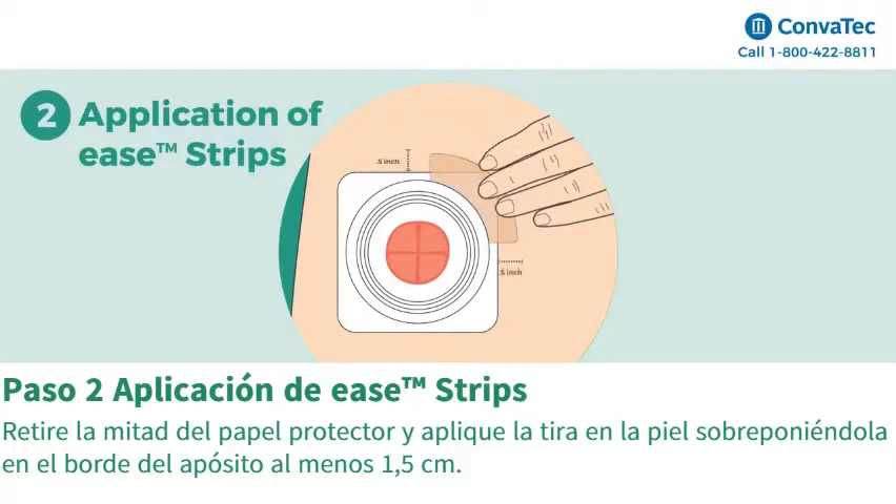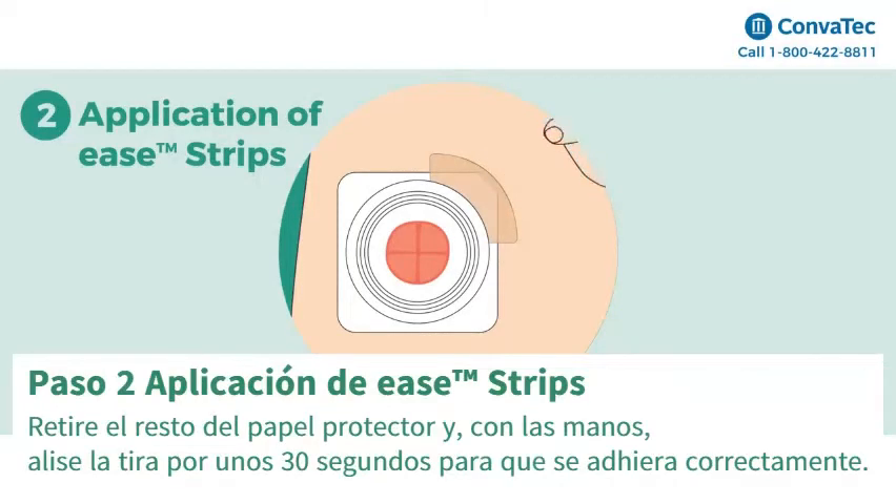The strip should overlap the edges of the skin barrier at least half an inch. Remove the remaining backing and smooth down for 30 seconds to allow the strip to adhere.